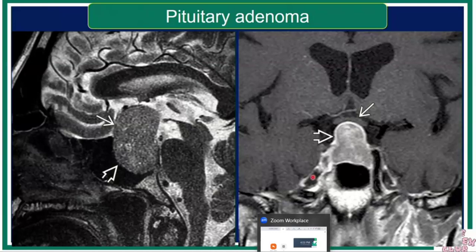Yeah. Can we get VIBE here? So we have 3D SPGR, which is like a VIBE. We don't routinely use it, but if this is something you would want to use, I think this would be more like a conversation with people who design protocols and see if we can do thin slice imaging instead of the normal. I think we do use 2 mm sections. So yeah, it's definitely doable. Maybe we can do it with a research protocol, for example.